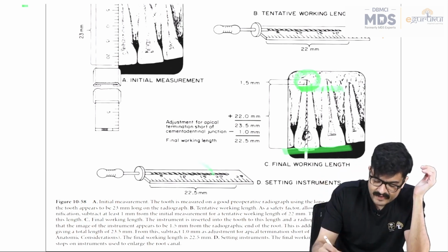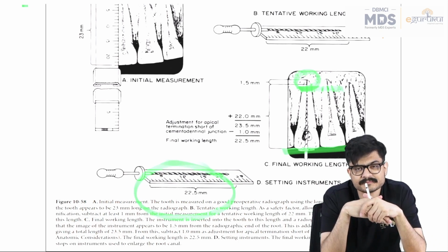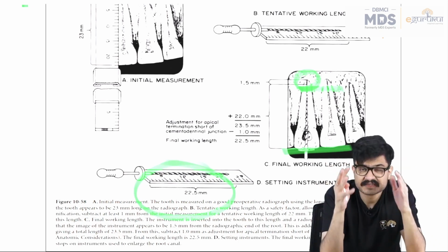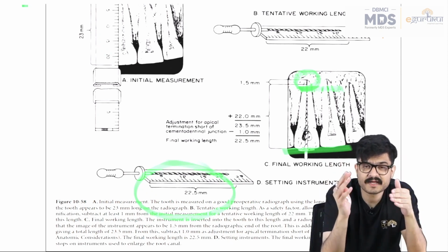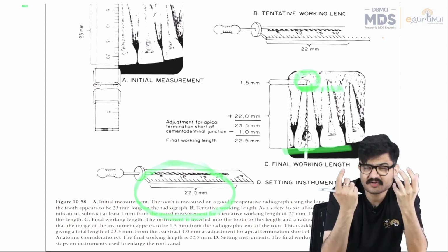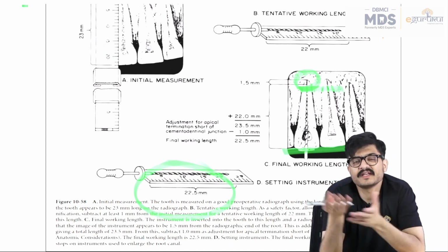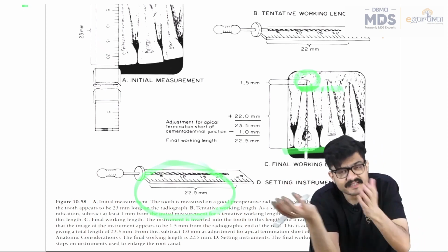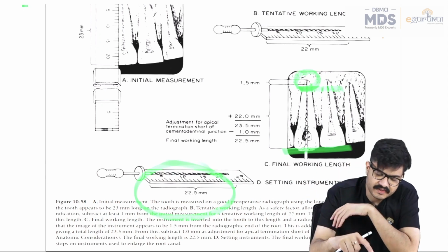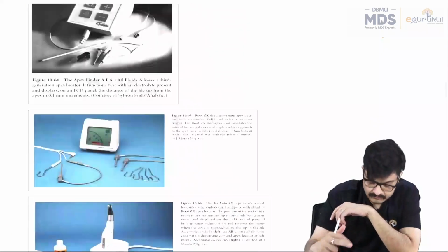So my final working length becomes 22.5 mm, friends. Right? Now this is a great method still used today. It's a more than 45, 50-year-old method given by Dr. Ingle. And just see the simple common sense with which it has sequentially reduced the error on the X-ray, isn't it? And given us this wonderful method of determining the working length by the X-ray, right?